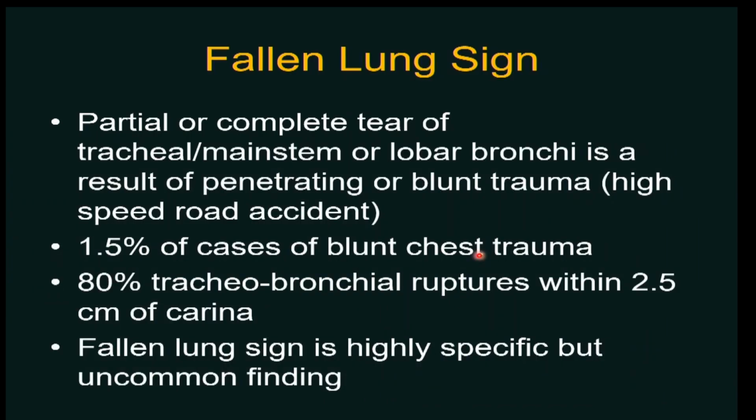Fallen lung sign, usually seen in cases of polytrauma, high speed road traffic accidents, wherein we have a lot of pneumothoraces, a lot of subcutaneous emphysema. It is very difficult for the imaging people in this scenario because the patient is very critical, with a lot of ICU tubes and lines, AMBUs and all those things.